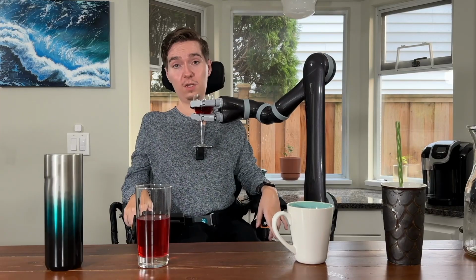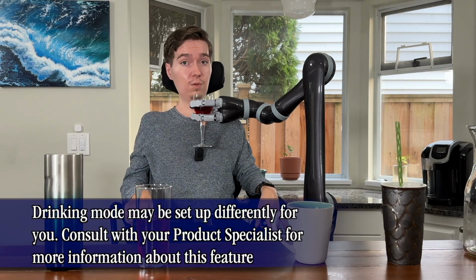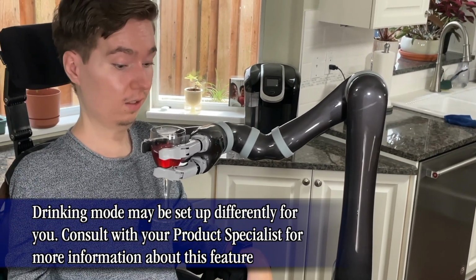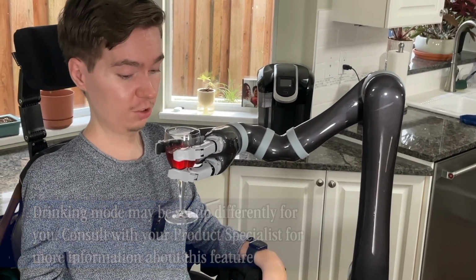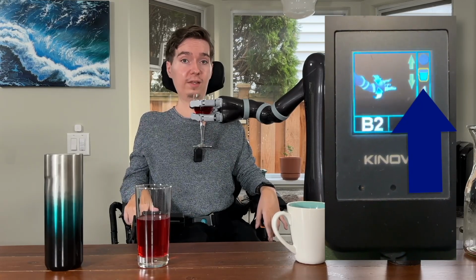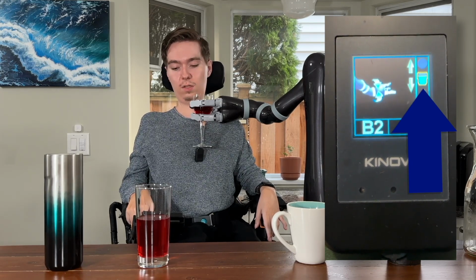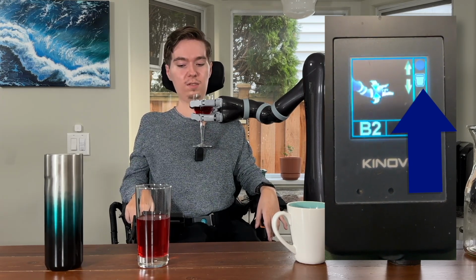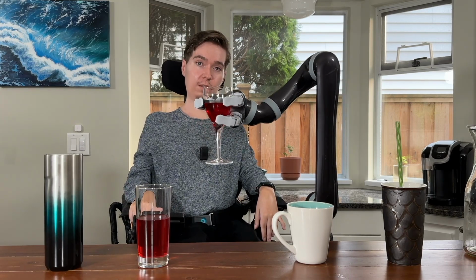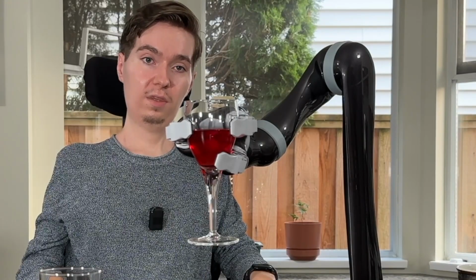And now we're going to switch into a special mode on Jaco called drinking mode. You can get into this mode by ensuring you're in mode B2 and long pressing on your accessibility switch for a few seconds, and you're going to see a little cup light up on your screen. This indicates that Jaco is now in drinking mode. What drinking mode does is it combines a couple of motions to make the process of drinking a little bit easier. I'm going to turn the hand here so you can see what the actual motion is like.